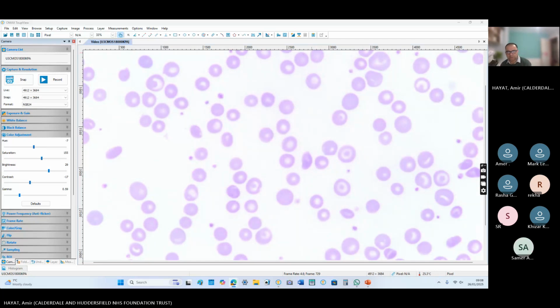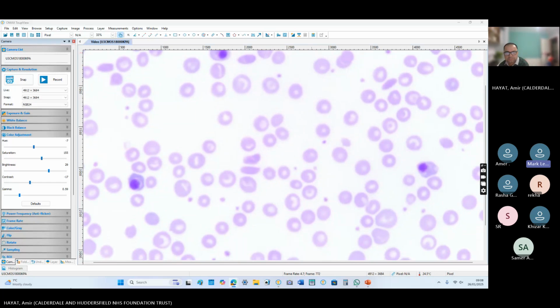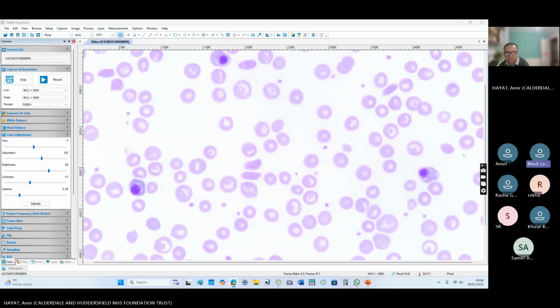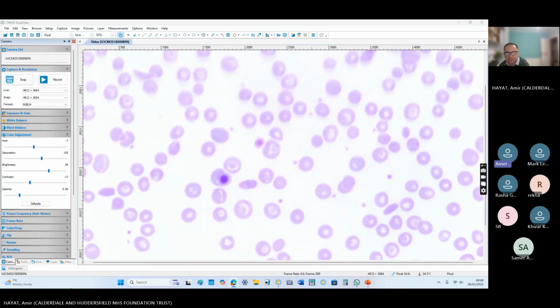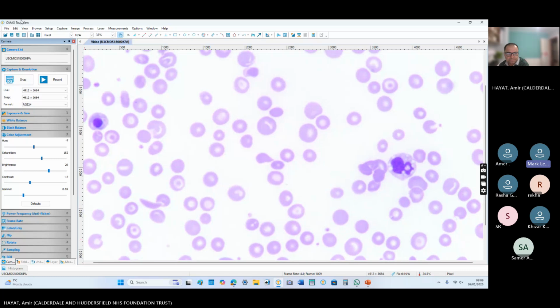Target cells. Okay. Anyone else? This could be like a variant, like an SC or something like that. He's a known sickle cell disease patient who has come with pain. But the question is, what are the features in the blood? List the features in the blood. Yeah, you see sickle cells quite clearly. Target cells, nucleated RBCs, thrombocytopenia maybe. What's the platelet count? Platelet count was 340.